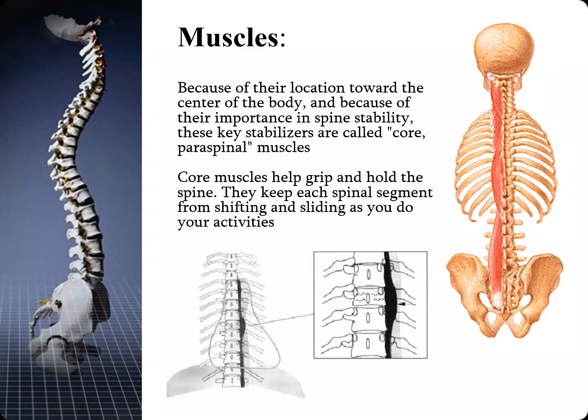Because of their location towards the center of the body and their importance in spine stability, these key stabilizers are called core paraspinal muscles. They are easy to discern on x-ray, and for trauma, if you can see that there is a displacement of the paraspinal stripe, you know — even though you can't see the fracture in the thoracic area — that you have a thoracic fracture.